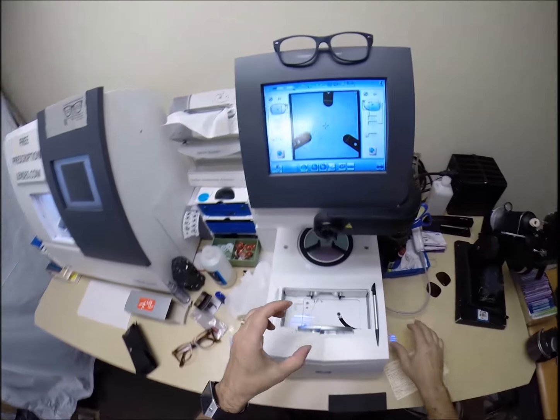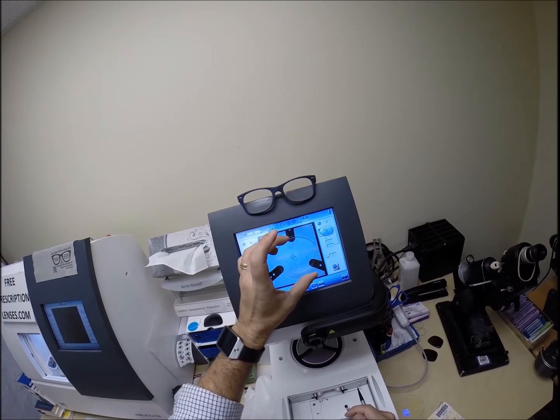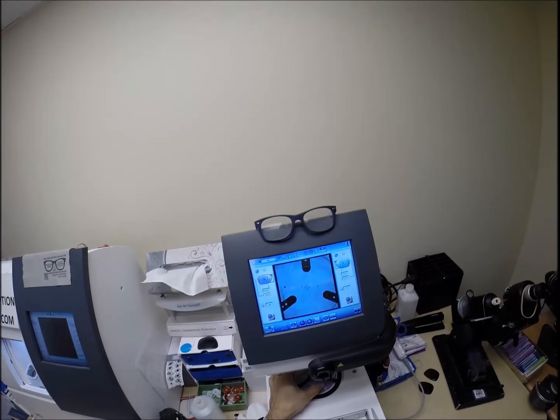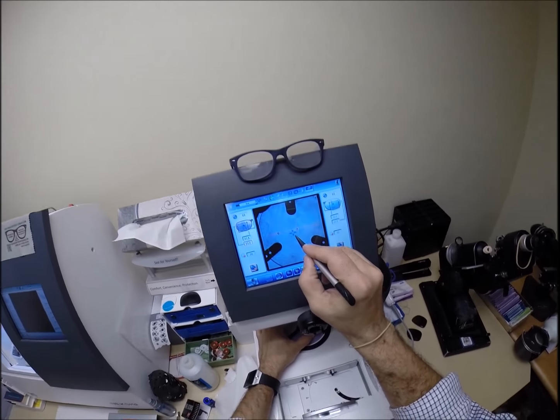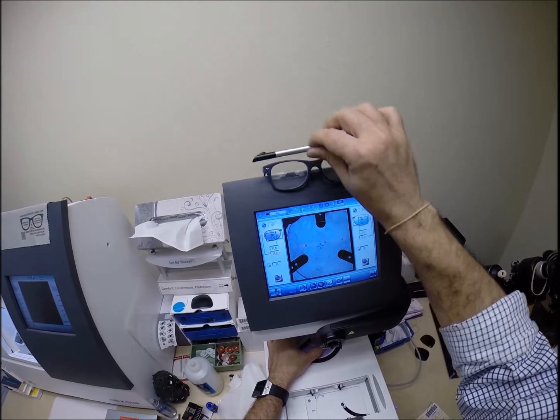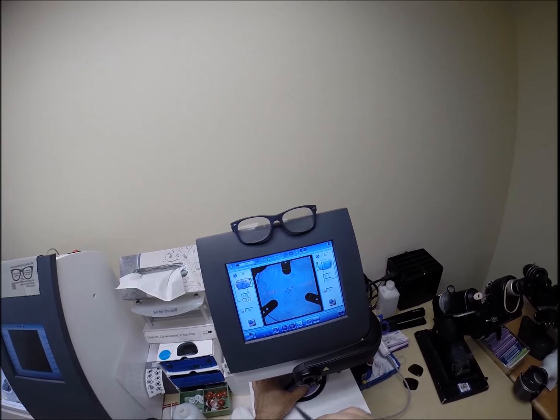All right, so we're going to take your lenses, put it in there. The reason why I put those 3 dots on there, it tells me that it's oriented in there just perfectly. So we're going to get everything lined up just right. The blue cross is the geometric center of your frame. If you were to measure vertically and horizontally, it would be dead center. Your eye is just above that in inset.